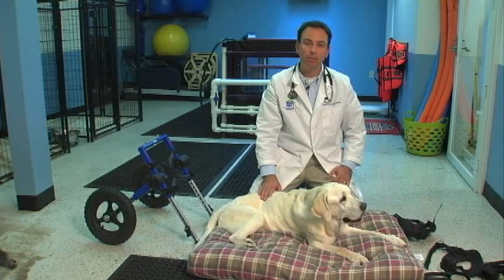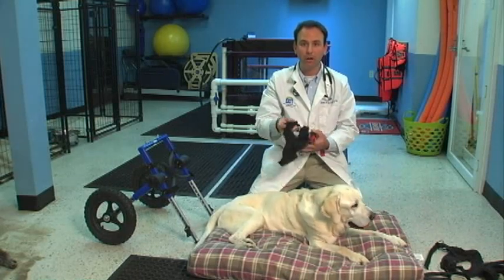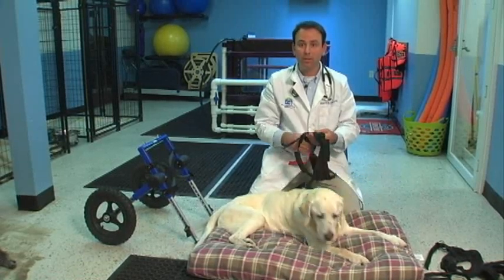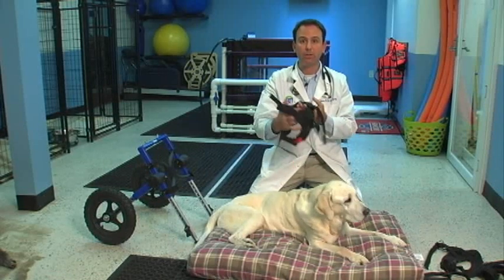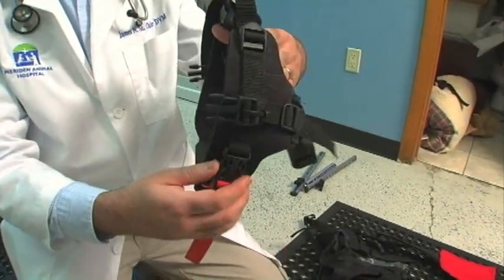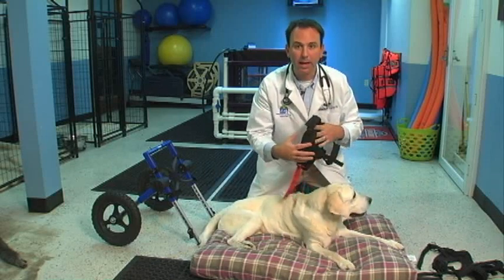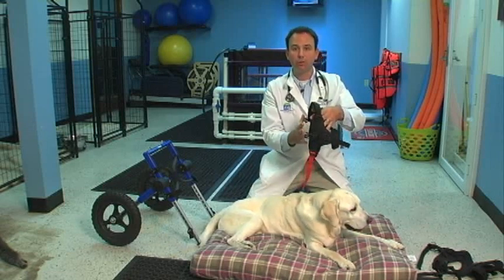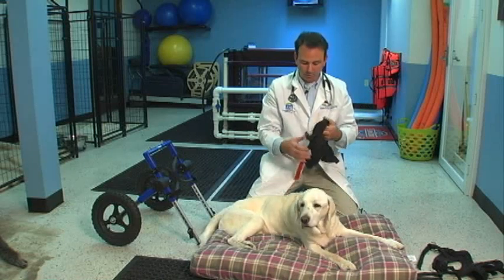All right, so first thing we want to do is take the harness. A lot of times people can get confused with the harness, and there are two key points about it. I suggest that you first set the harness up and hold it so you get oriented with what the front is and what the back is before you start trying to throw it on your dog. What you first want to see is that the red strap is on the bottom, okay? And then there are side panels, and on the side panel is a clip. You want to make sure that those two clips are pointing backwards. All right? And that'll give you a good orientation for putting it on.